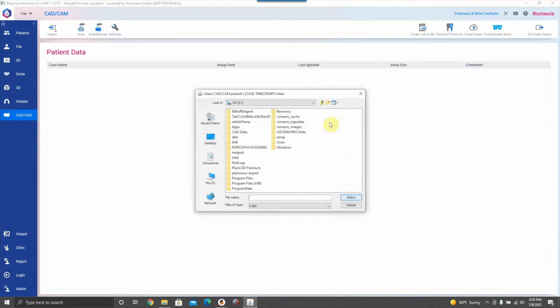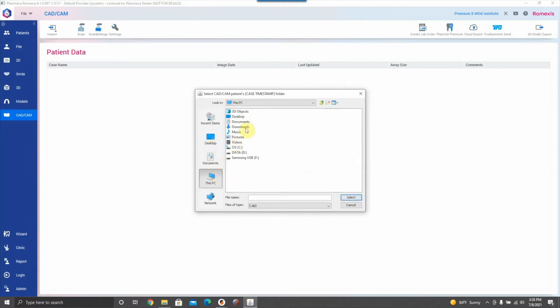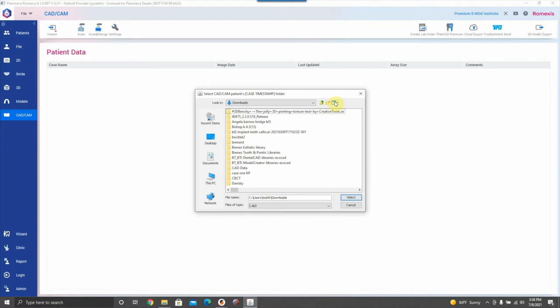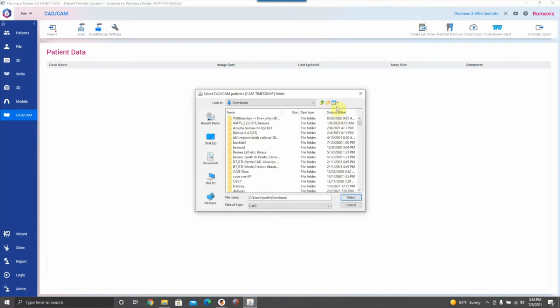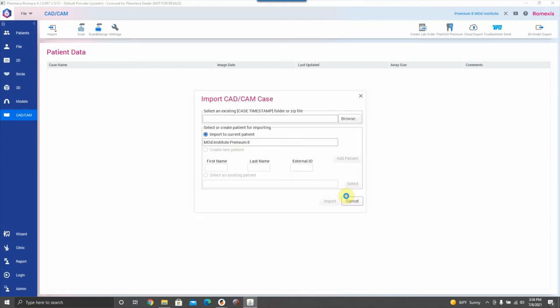Find that download — for me it saves under my downloads folder under the filename veneer11. You have to keep that native filename. Once it's loaded and you've selected that folder, hit Import. What it's doing is transferring all the data from the zip file into the Romexis directory, as if you scanned it natively into the software.